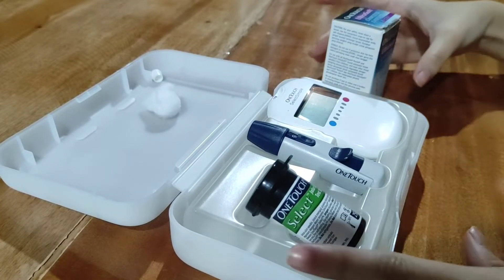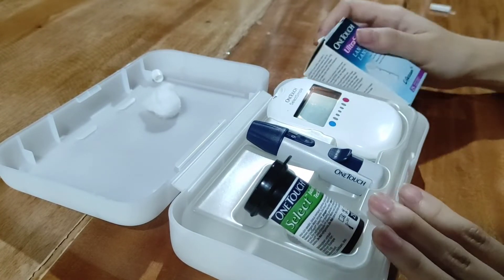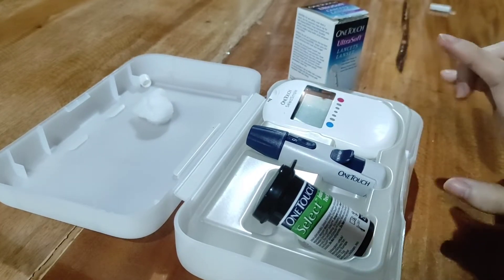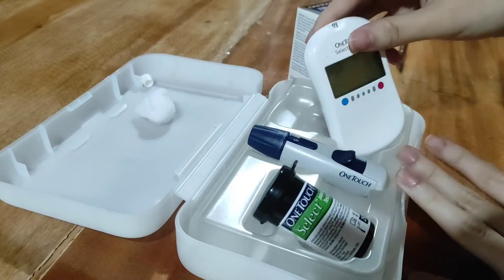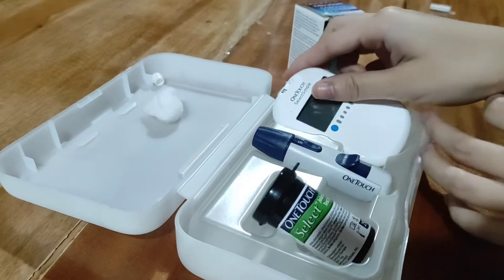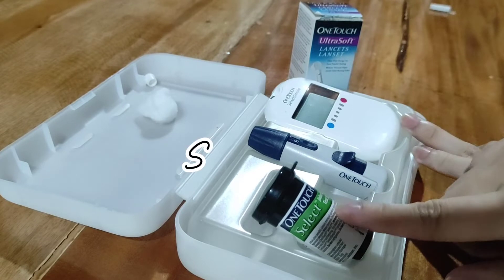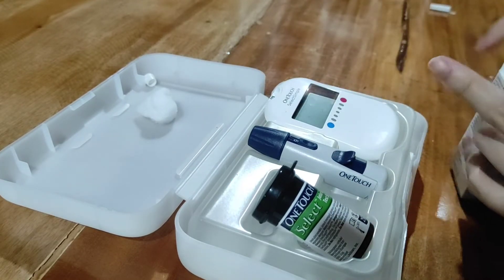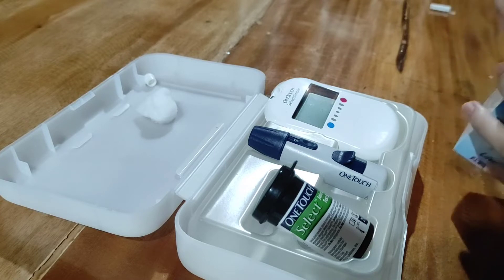This is our blood glucose monitoring devices. We have here our glucometer, our lancet device, our strip, and our lancet. First, kukuha tayo ng lancet.